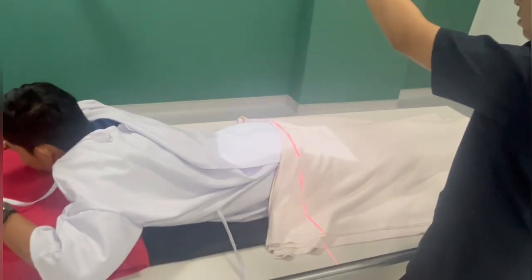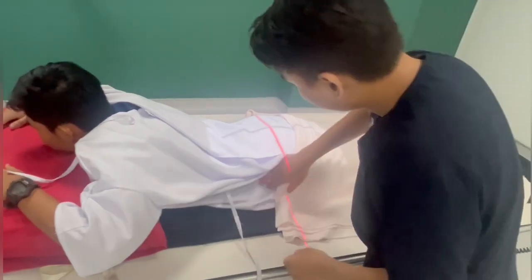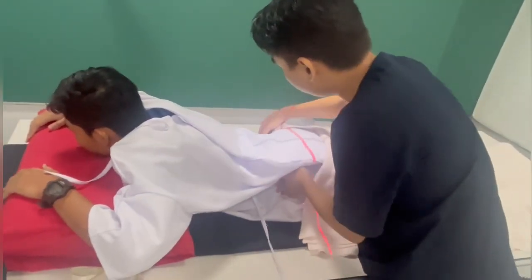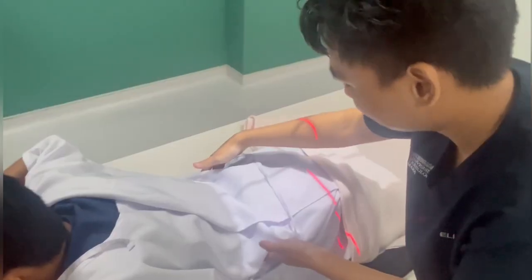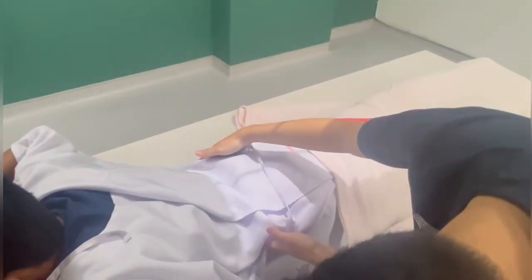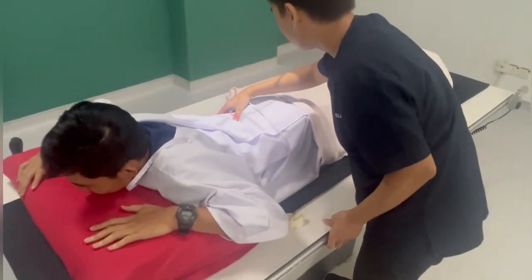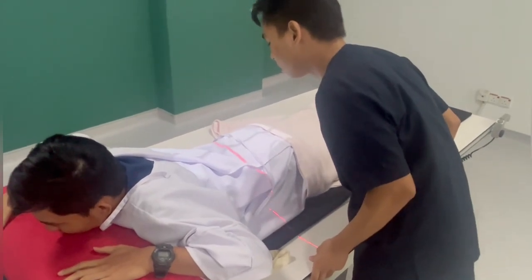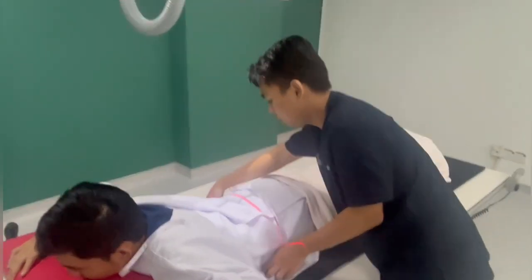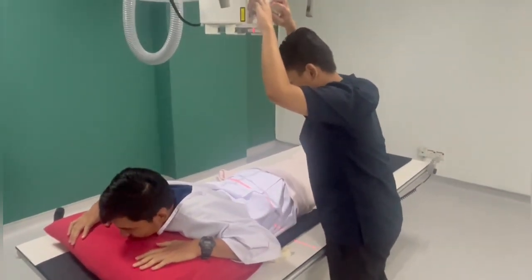The center point of this projection will be at the level of the iliac crest. Now go to free the table and then palpate the iliac crest. Once you find both of the iliac crests, you can use one of them to identify the point, and then move the table so that the center point will be at the level of the iliac crest, which is the midline or the midpoint of the level of the iliac crest.